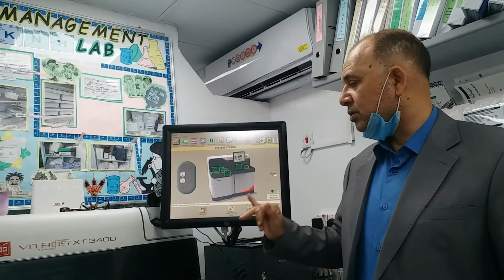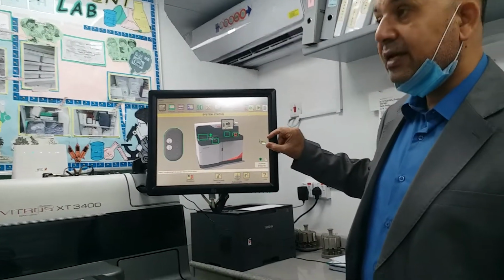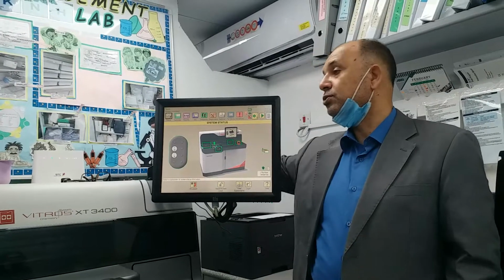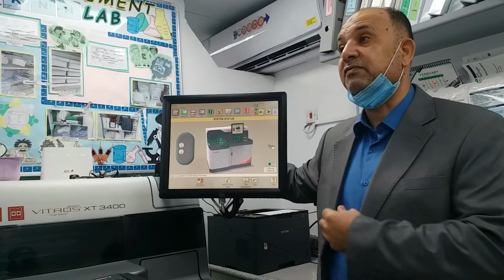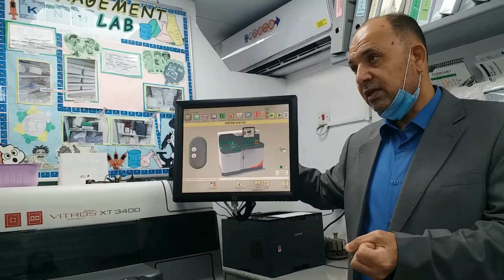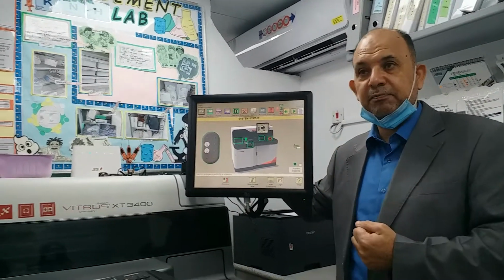This is number one: the access, how to go through it, you know from where to go. Number two, this one is like an inbox. We use it in case we have something coming from the manufacturer company through the router, because the machine is also connected to diagnostic in France. So in case we have any special software update, or any new ADD update, it will load to the machine automatically. Then I have to load it from the inbox.